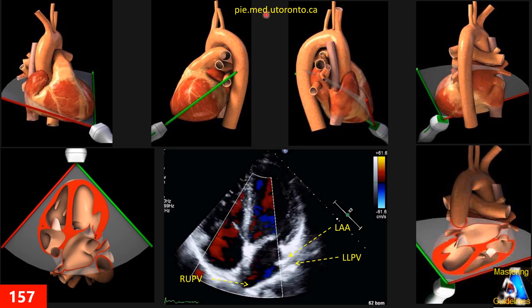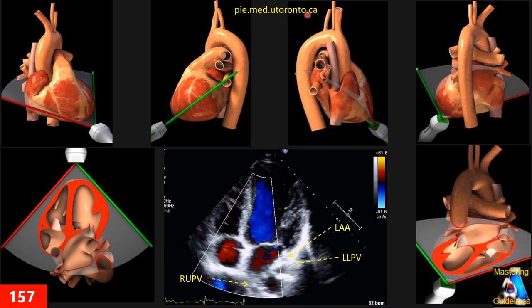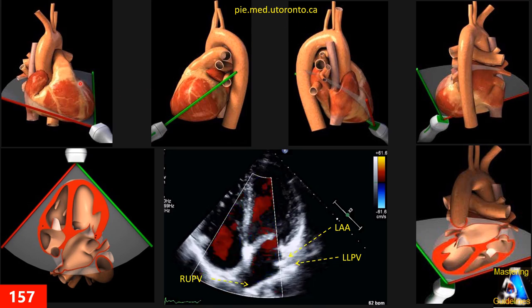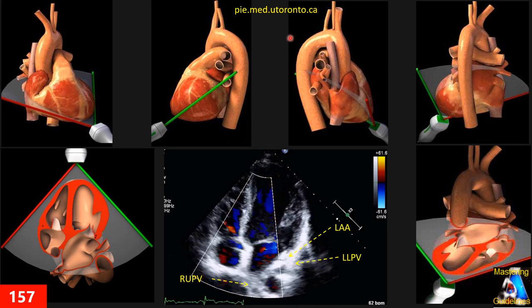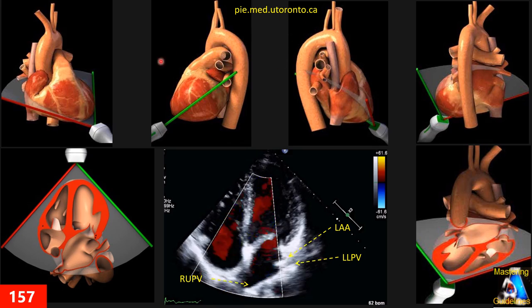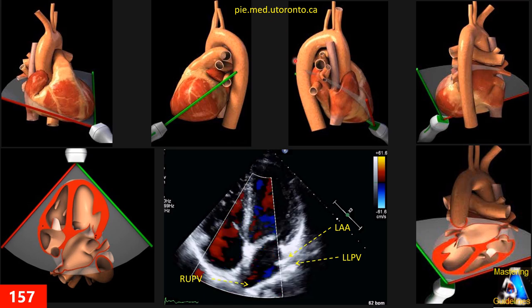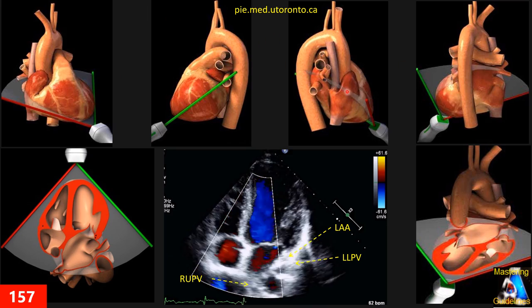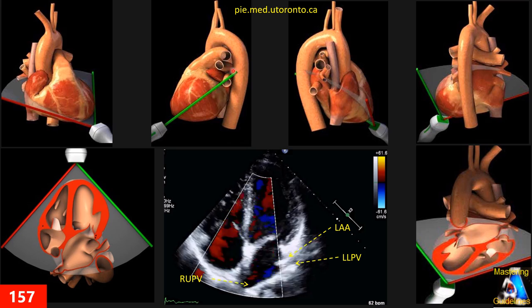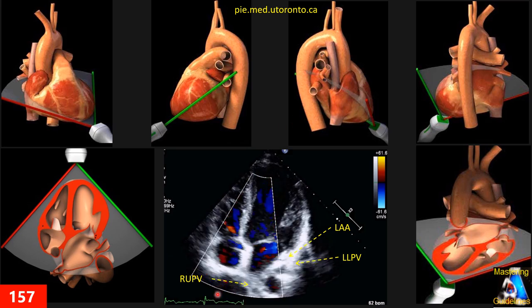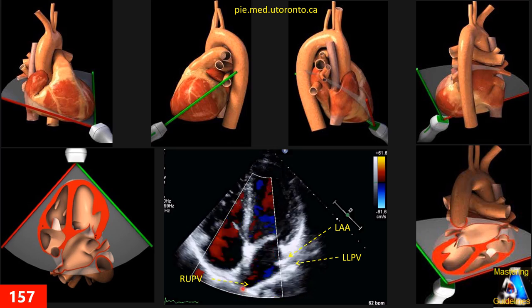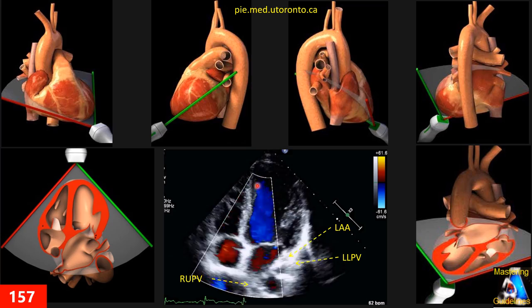I want to remind you that all the schematic pictures shown are from the University of Toronto. Visit their website — they have a very practical and useful virtual echocardiography software where you can practice all sector views and anatomy. Now let's see how to correctly optimize the pulmonary vein and perform pulsed Doppler with measurements in the apical four-chamber view.